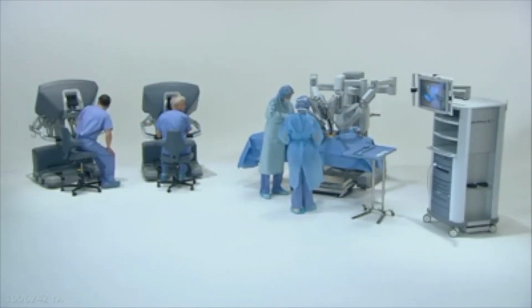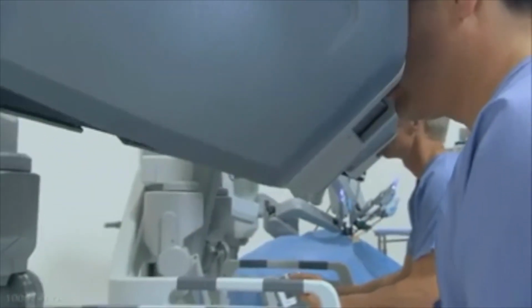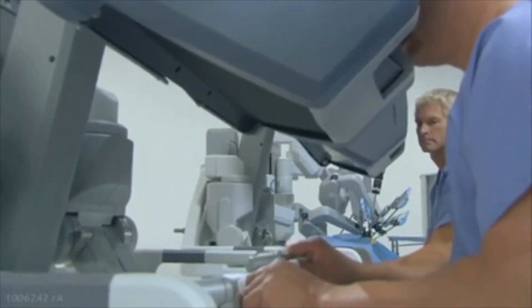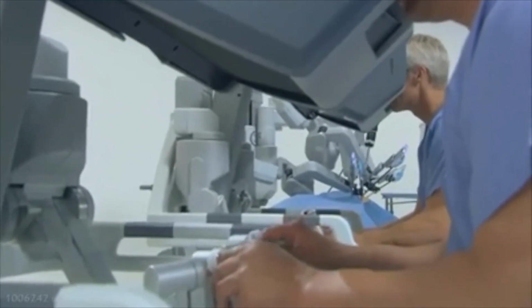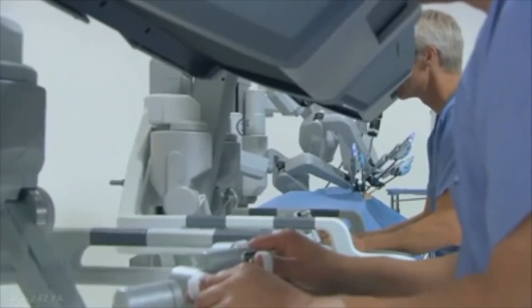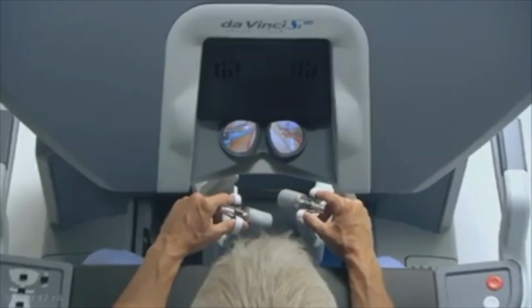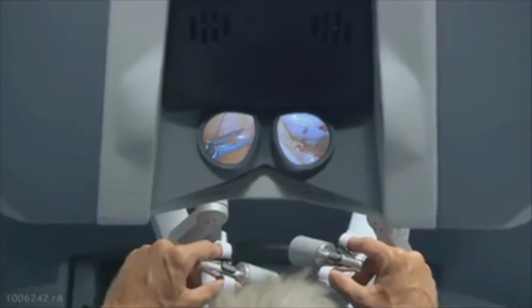People get a little bit nervous when they hear about robotic surgery, and they think that it's just a robot and the doctor's in the corner taking a nap. But it's really just an extension of the surgeon's hand. It's similar to a scalpel or other surgical instrument. It's a robotic device that the surgeon is able to control, and it gives us magnified 3D vision so that we're able to see much clearer and identify structures that we normally wouldn't be able to.